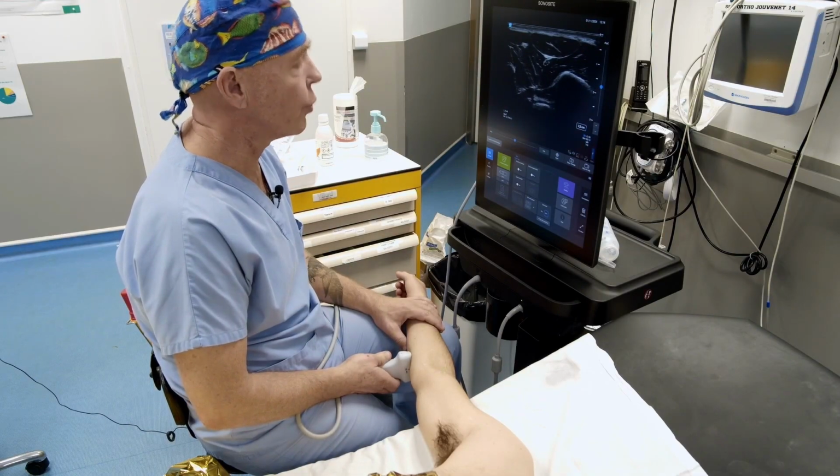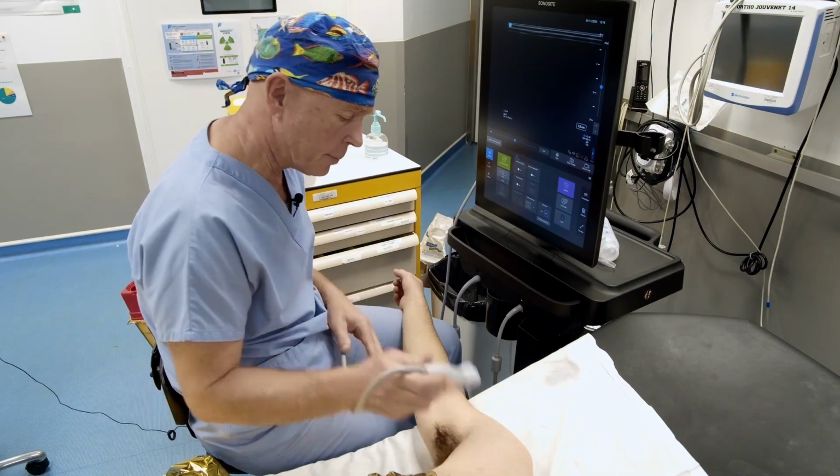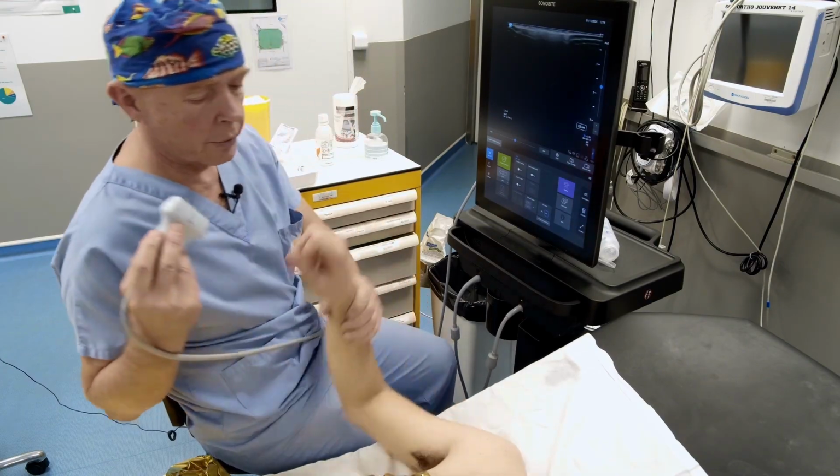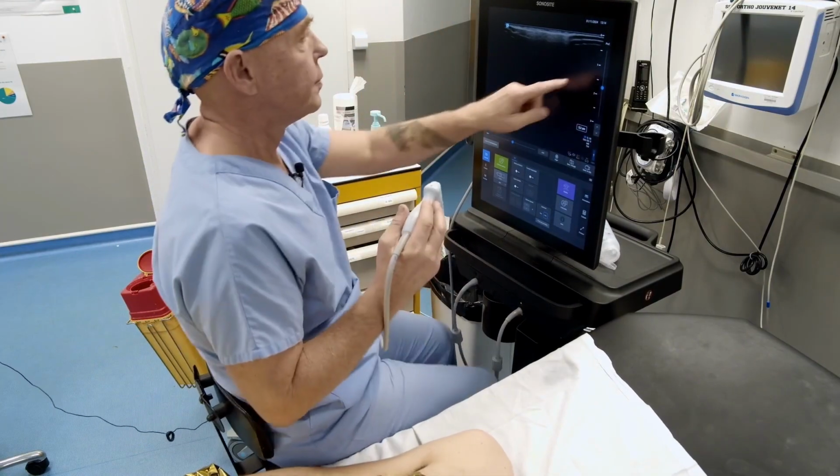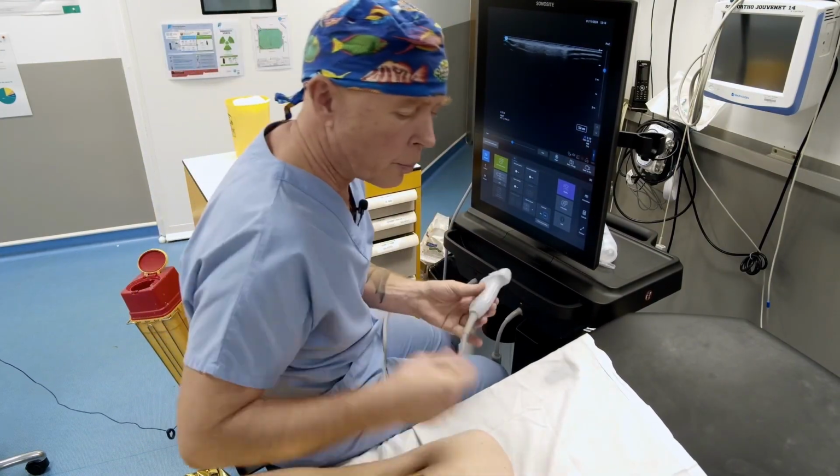So here we clearly see the elements we looked at right at the beginning. So we'll move right along to the upper limb blocks, starting with the interscalene block.